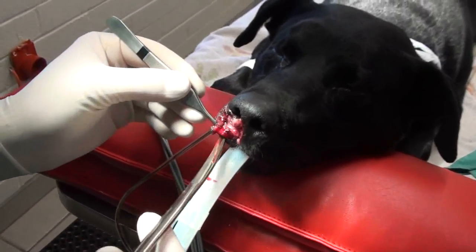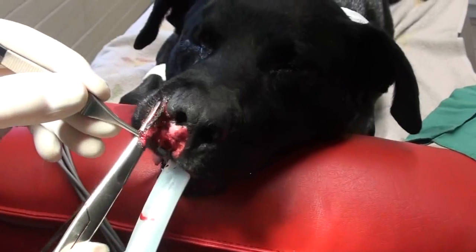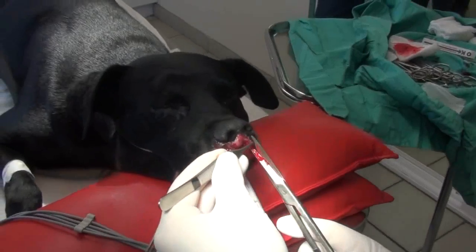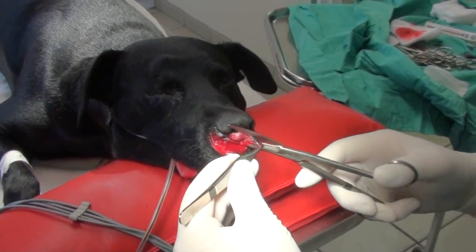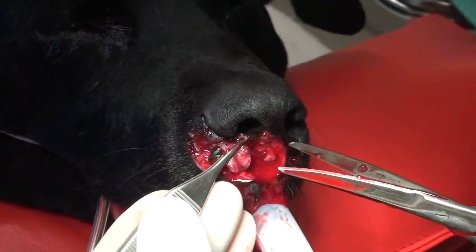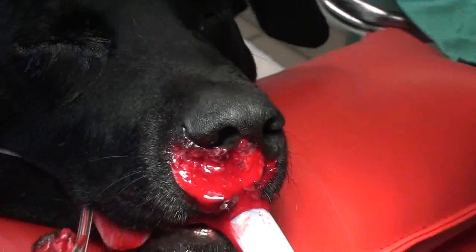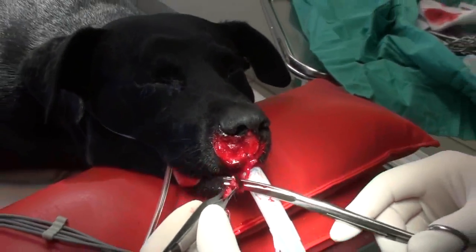What I've done is cut the tissue so it bleeds again, just like new — just like it just got cut. So I'm cutting along the skin to make it really pretty and straight. It's called debriding. Debriding is taking the ragged tissue and cutting it off, but we don't want to cut too much because then we have to pull it together — we need tissue to pull it together. This is just swollen tissue, get rid of that. We want to make all this tissue nice and fresh again and straight. We've got to take an old wound and make it nice — it looks bloody now, but that's good because we need it to look like it just got cut. It'll heal faster once we get all the old dirty tissue out.